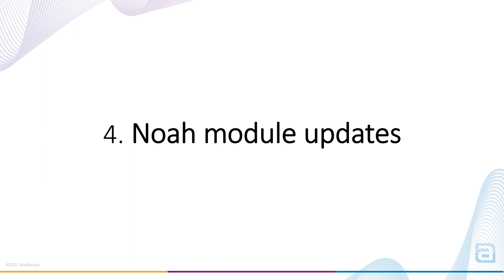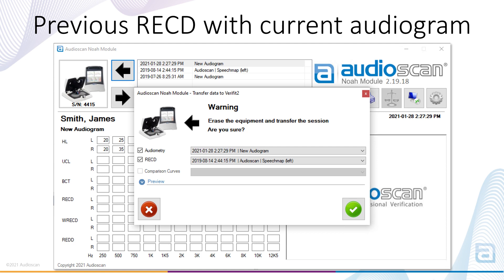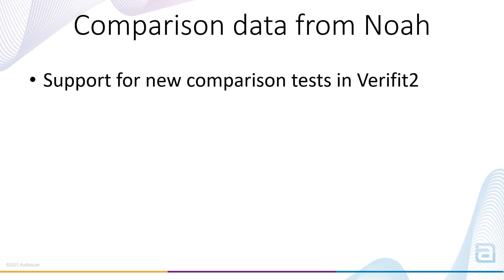Noah module updates. The first Noah module update is the ability to pair a previously measured RECD with a current audiogram. While it is typical to have a newly measured RECD whenever a new audiogram has been stored, in some cases the audiogram may have changed but a previous RECD is still appropriate — for example, when using individual RECDs measured on adult ears. As shown here, the window which pops up when sending data from Noah to the Verifit has changed. The first selector shows the assessment data action which will be sent over, defaulting to the most recent audiogram, and the selector below allows the clinician to select a stored RECD which may have an earlier date.